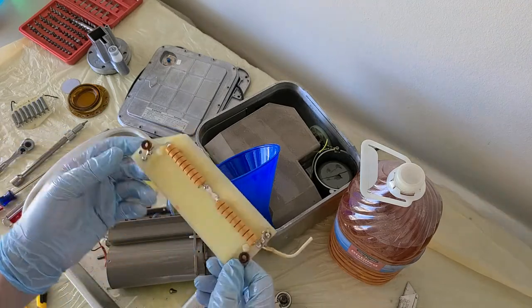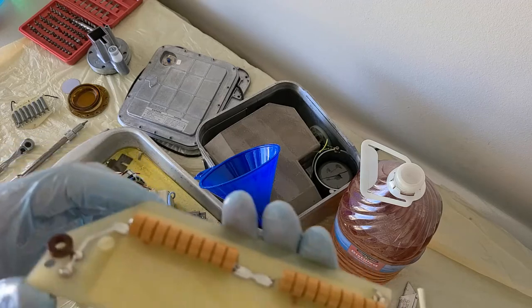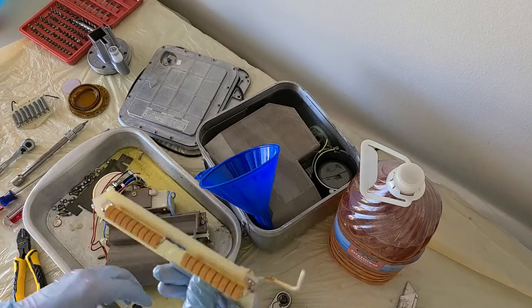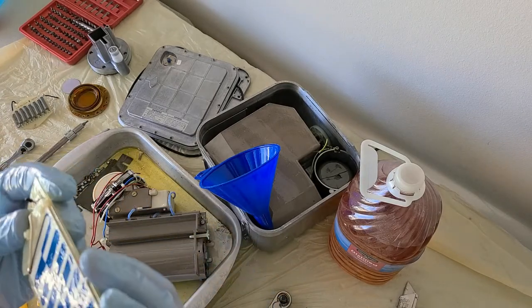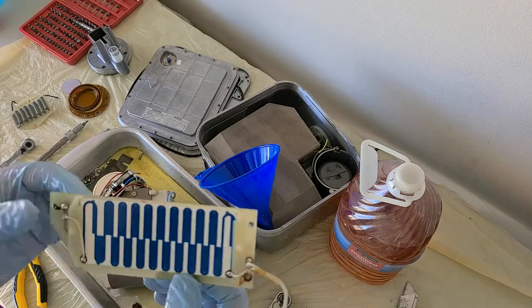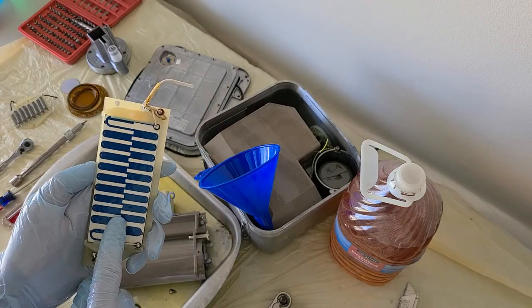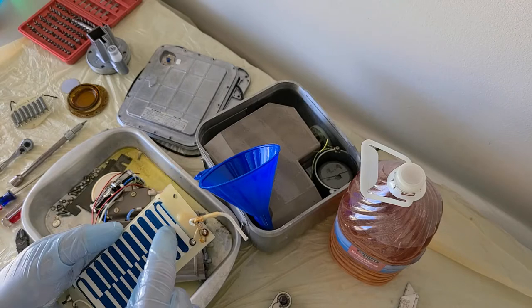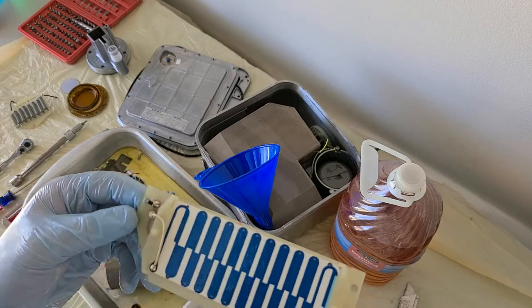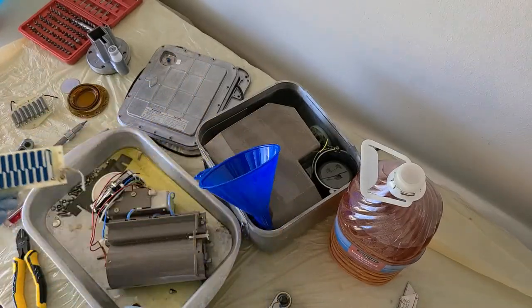I have no idea what this board is, I've never seen anything like these. Keep in mind this is from like the early 90s, so technology now is a little bit different. Uh-huh, makes sense. I believe this is a heater, it actually warms up the oil to temperature. It looks like a bunch of resistive elements. Yeah, that's what it is, most likely some kind of heating unit to keep the oil warm.